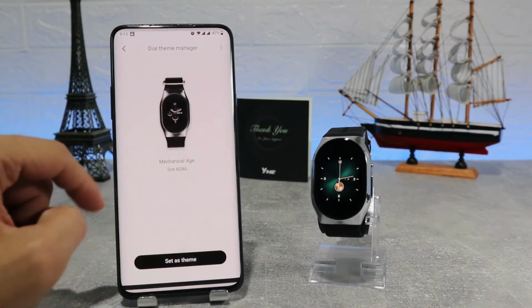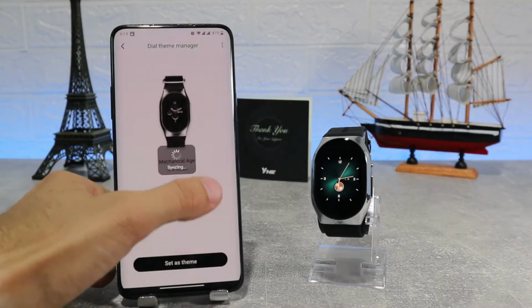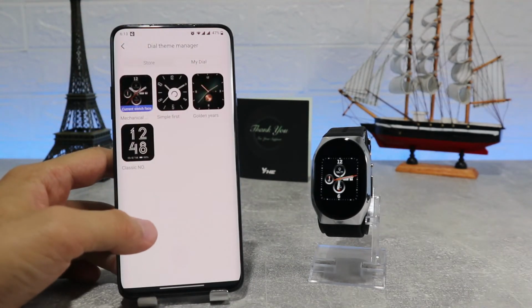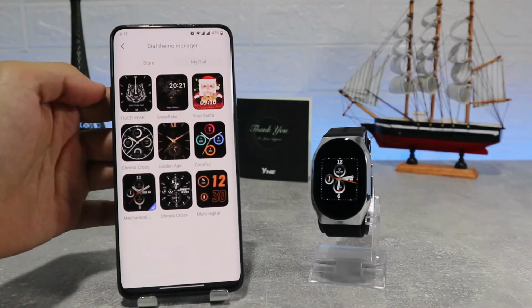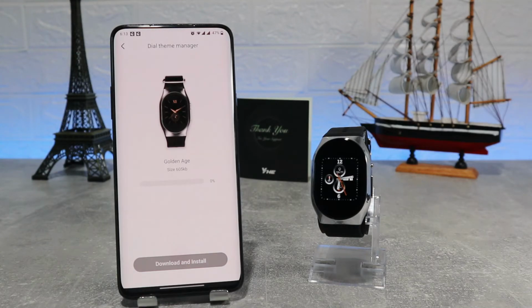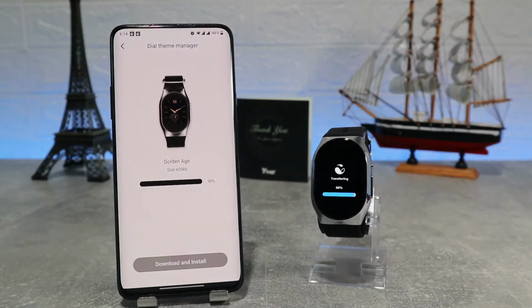Next, we have My Dial, which lets us choose from a different variety of watch faces. You can choose whichever you like best and it will change automatically. You have your local faces, and then you have online faces, which if you need to choose one you need to download it first, and after you have done so, you can apply it to your watch.